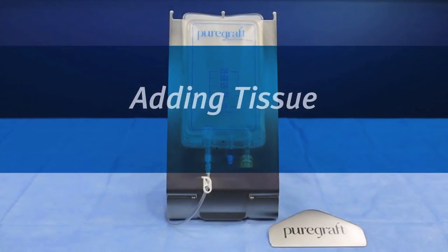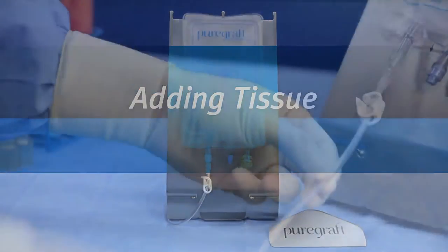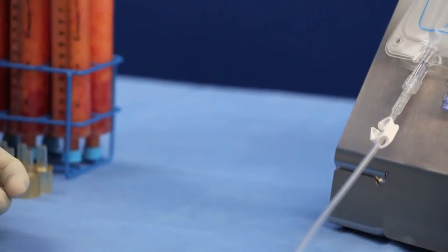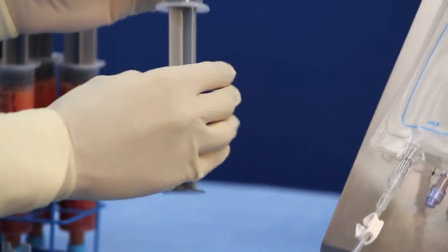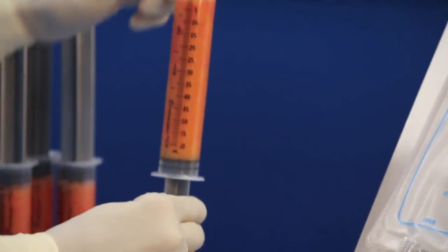Tissue is added to the PureGraft through the tissue port. Adding and extracting tissue through the inlet port using a luer lock syringe increases the risk of clogging and is not recommended.